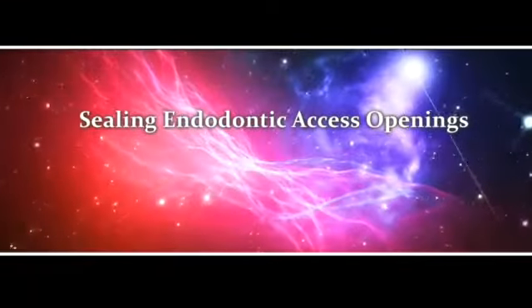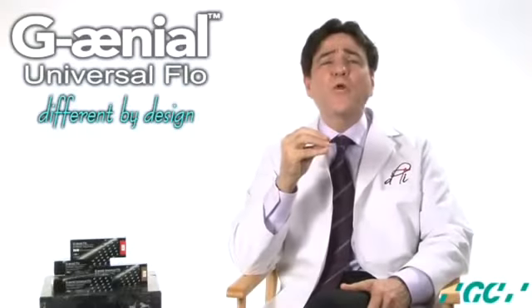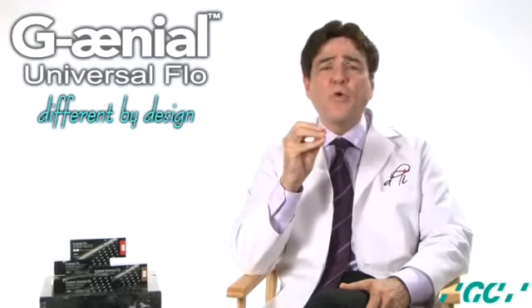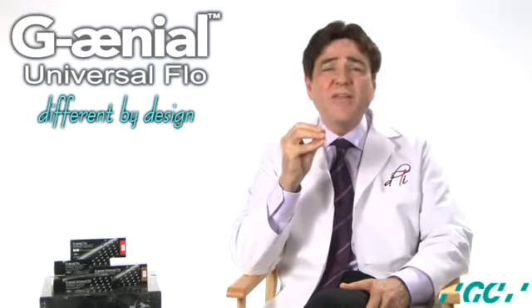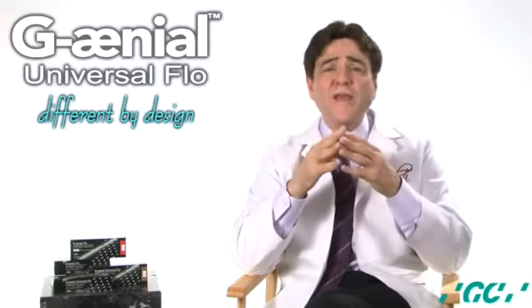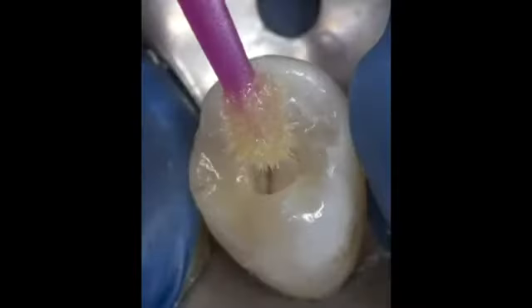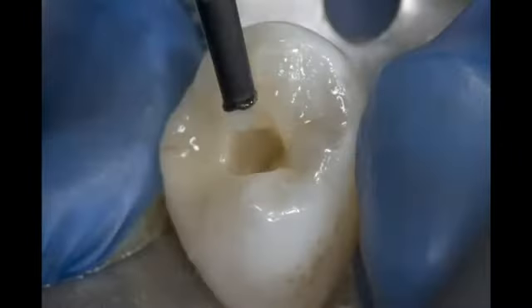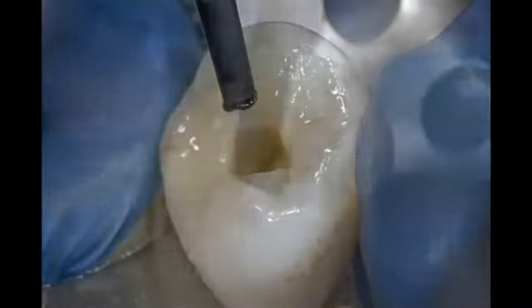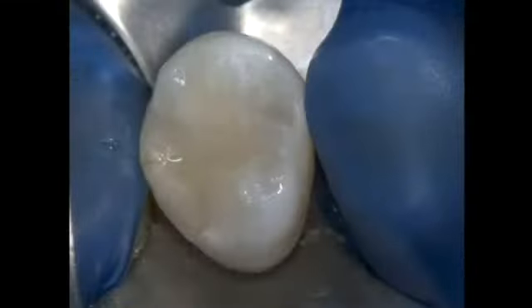Sealing endodontic access openings. An inadequate coronal seal after endodontic therapy can allow saliva to reach the apical region of the tooth in as little time as 3 days. One material and method that can be utilized for sealing the endodontic access opening is a simple technique that involves self-etch adhesives such as G-aenial Bond and a next-generation flowable. This bioadhesive procedure can restore or provide a transitional seal until a new restoration can be placed.